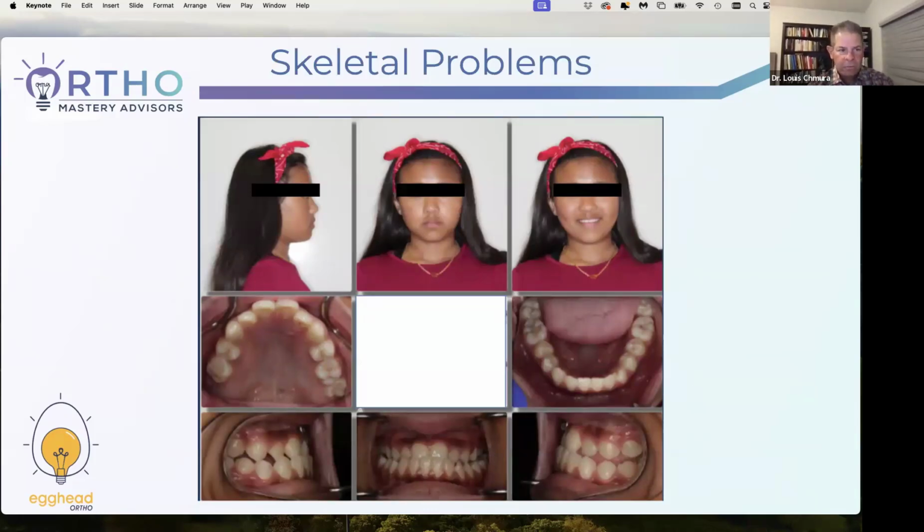Here's a young lady. This is one of my patients. The upper second bicuspids were impacted and she's class 3 looking, right? This is one to try and do this with aligners. What a nightmare. Not worth it. We used class 3 motion. We corrected the class right away. We ended up extracting the upper second bicuspids. Then we put braces on and lined everything up. She was done in a good, easy portion of time. But my goodness, to do this with aligners, just to bring that lower left cuspid up and rotated is going to be a nightmare with aligners. This is one I would punt.